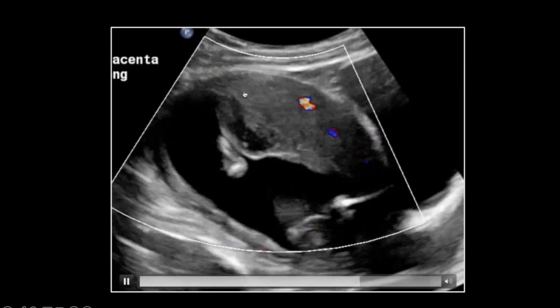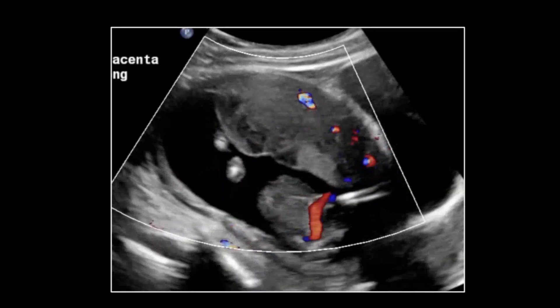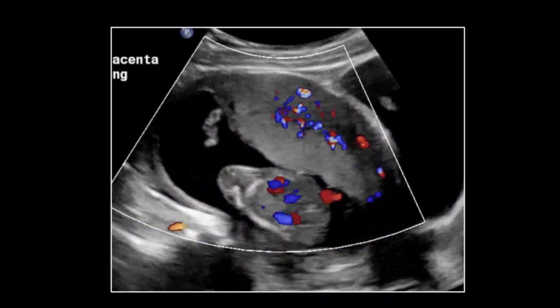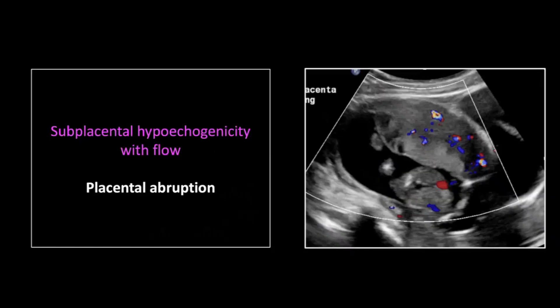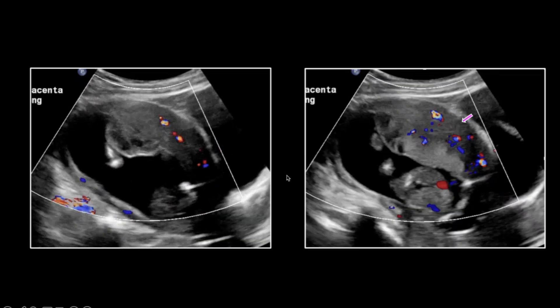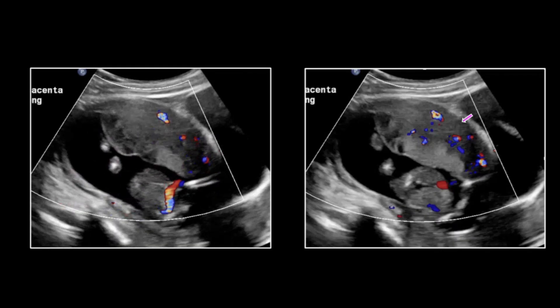Most placental abruptions involve a marginal edge of the placenta, which you can see this one does as well. The ones that are really dangerous are the central ones, because they don't present with bleeding as early and they develop really high pressure before they blow. But the vast majority of abruptions involve the margin. You pick out the thickness of the myometrium in an uninvolved area — find that thickness and echogenicity underlying the hyperechoic placenta. Placental abruption is a tough call to make, but it definitely falls to us.